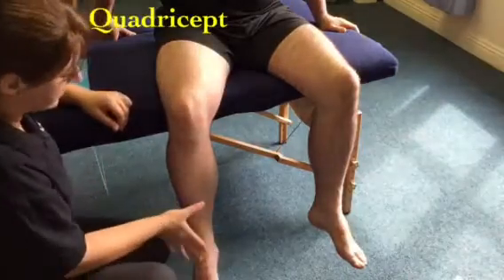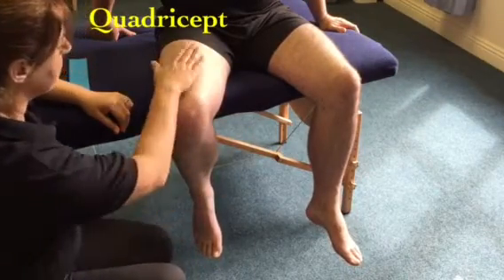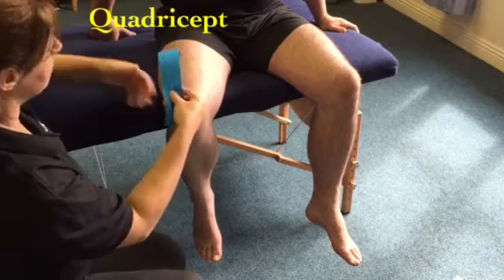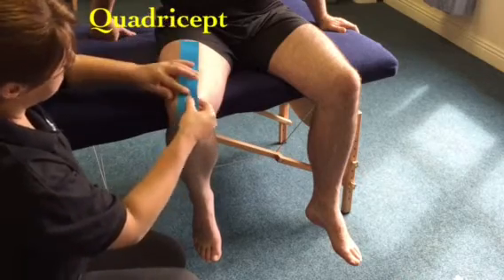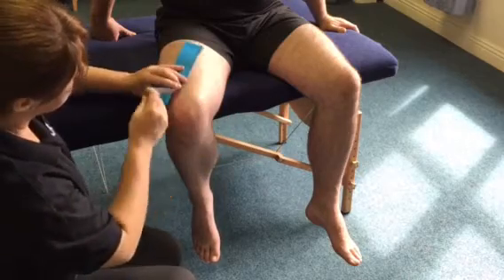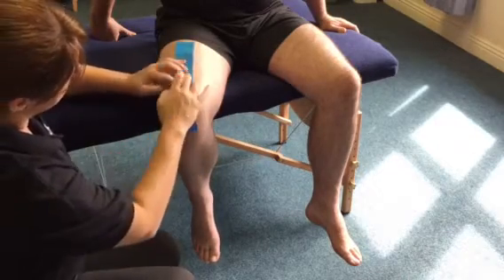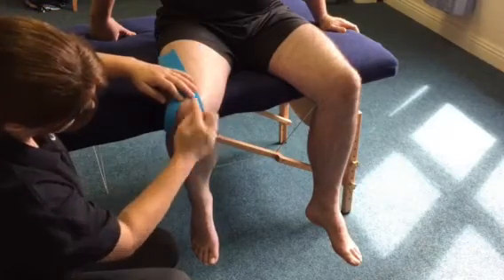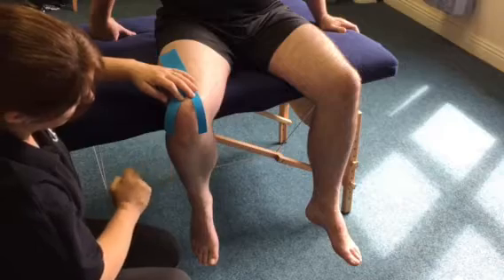First I'm going to ask my client to just bend the knee back a little bit further to put a stretch on the quads. I have my kinesiology tape cut already — one long wide strip. I've cut a little piece up along here and measured it out so it covers the quads enough, and it's long enough to come down and around to the bottom of the kneecap.